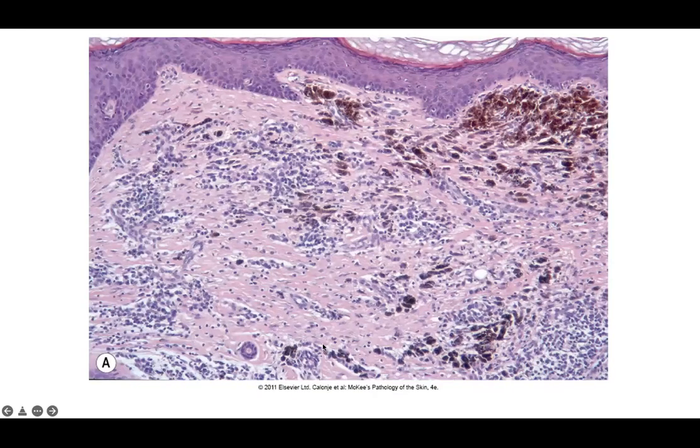Here you can see some scattered melanoma cells within a background of a scar-like fibroblastic stroma and areas of scattered melanin pigment, which could include melanocytes or melanophages, depending on if they were SOX10 positive in the nucleus.